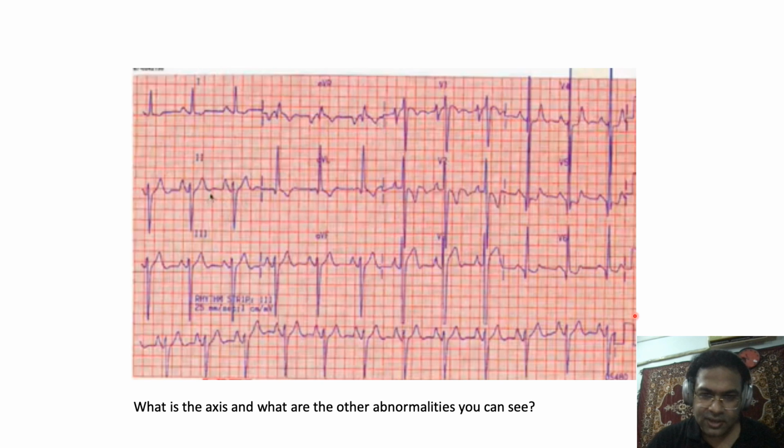Here is a box, a signal box. This signal box will indicate whether the voltages are depicted correctly or not. Always this should be 2 large boxes. If it is less, that means half standardization, and you will get wrong QRS complexes.